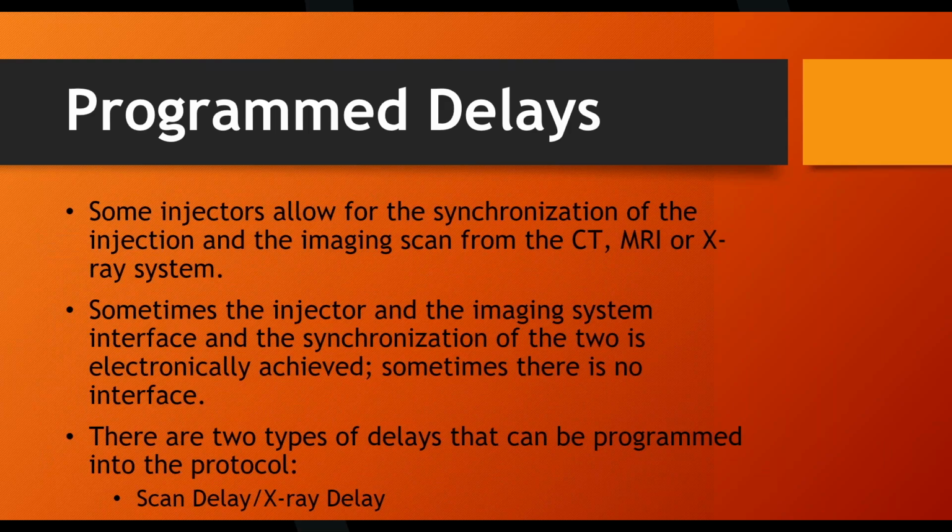Now, an inject delay is one of the buttons on the protocol. You'll say, yeah, Paul, inject delay 2 seconds. So what will happen now is when I hit the start switch on the injector, it doesn't immediately start injecting. I hit that start switch, it counts down 2 seconds, then it starts injecting because it wants to get the CT system rolling and start the scanning before we get to the fluid.